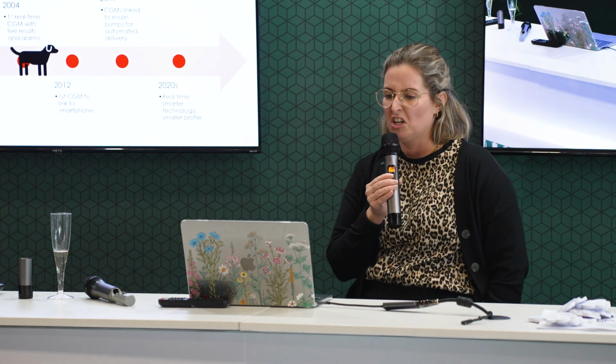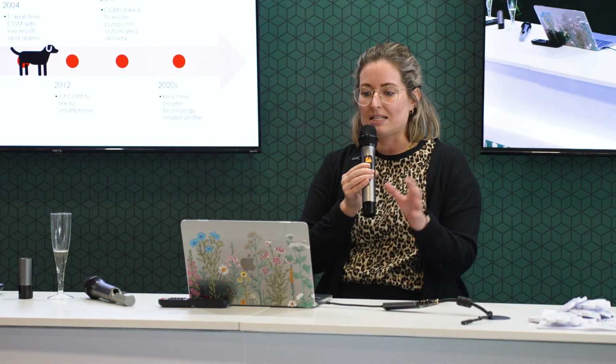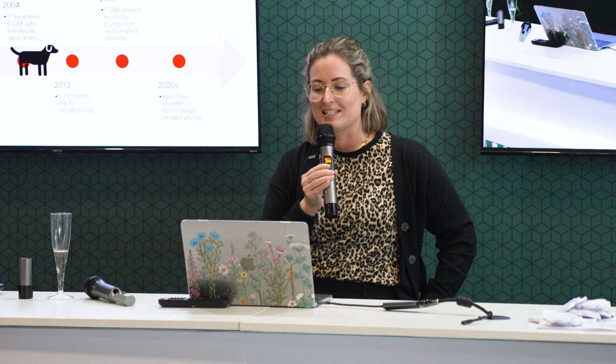Now, in terms of our veterinary patients, I tried to have a look back at when these first started to be used, and it was around 2005-ish that they started to be used in veterinary care settings. But these devices, as we said, were much more primitive. You had to have a device that you scanned. There maybe was a time lag. And so I think it's nice to see today that we've come a very long way since then.